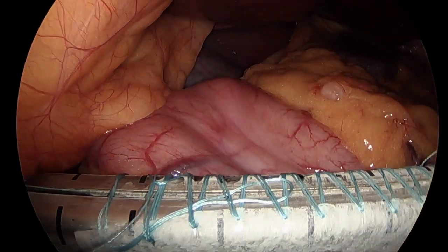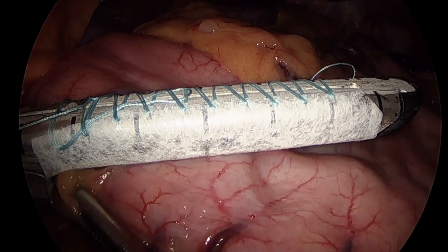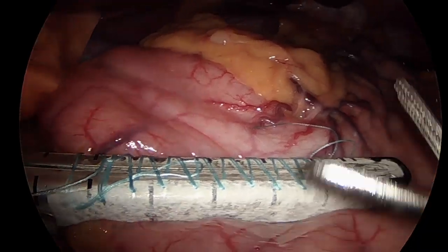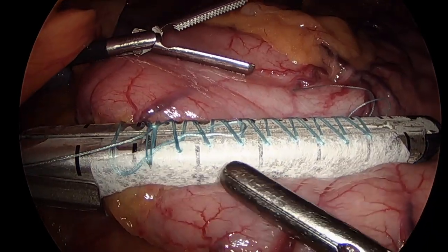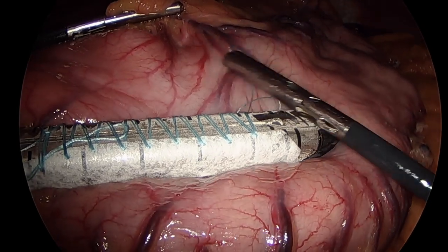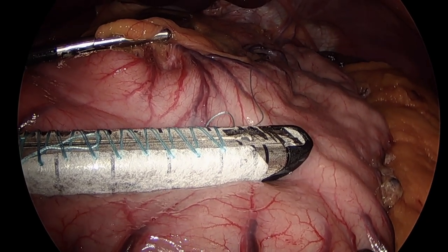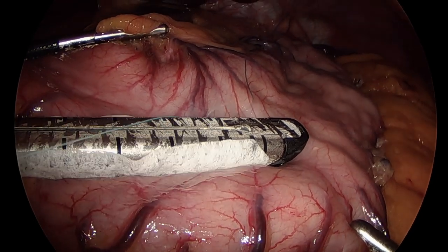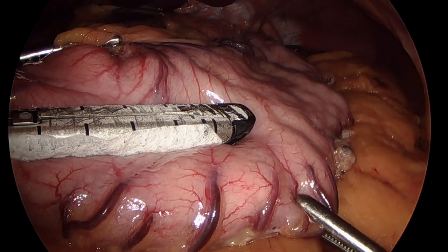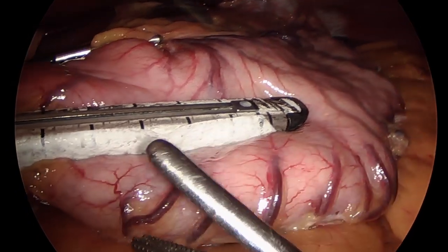We first ensure that the antrum is flat in preparation for our first staple fire. The left-handed grasper stabilizes the stomach at the junction of the antrum and the body. For this case, we use a powered stapler device to perform our sleeve gastrectomy. Before alignment, we ensure that our orogastric tube is removed. We position the stapler so that the staple fire is flat and even with the stomach, and articulate the stapler slightly right to ensure the area at the incisura is not narrowed. We partially close the stapler to grasp the stomach, the left hand adjusts the stomach at the incisura to verify appropriate positioning, and the stapler is fully closed and fired. The first fire is important in determining the starting point of the sleeve gastrectomy to ensure all of the disorganized segment of the stomach will be included in the specimen.